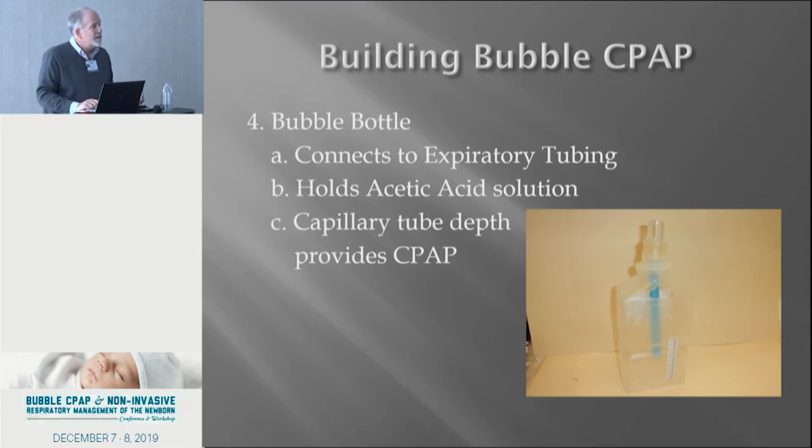Don't know about today. As I said, I'm not in the manager world right now. But at the time, acetic acid was the same price as buying a bottle of sterile water, cost to the department, so we used the acetic acid upon request of Dr. Alley. And you'll see in the bubble chamber there that inside the chamber we change back to blue. And the reason for that is just because when it's clear, it's really hard to see. Okay? No special reason. Inspiratory and expiratory limb, the color was arbitrary.